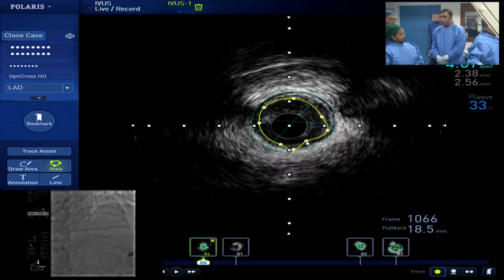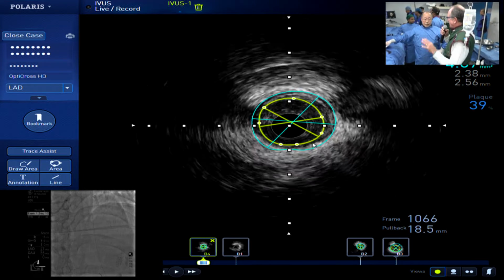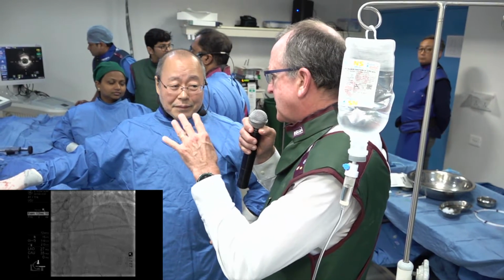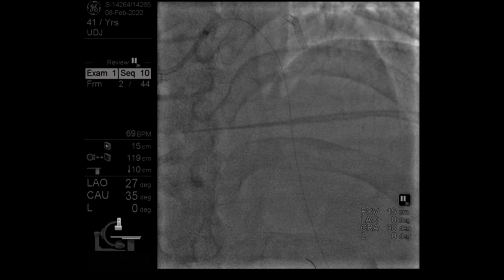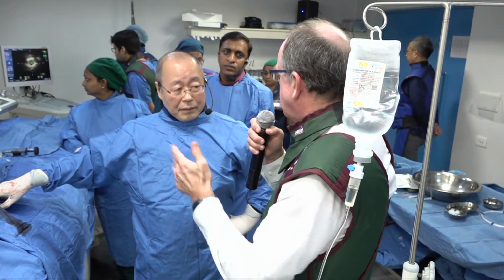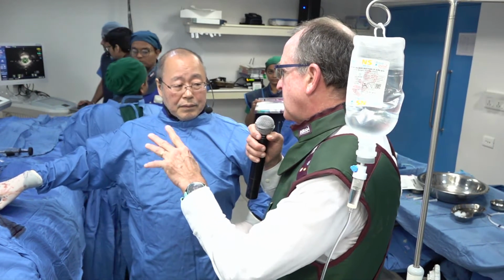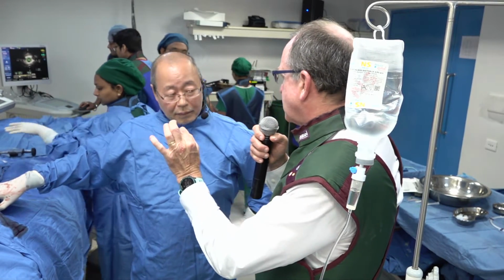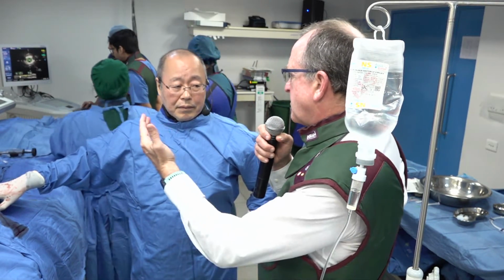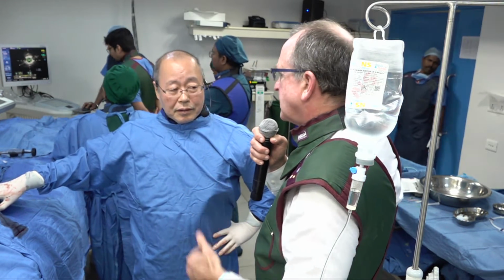I heard you discussing that this has been occluded for a while. It may be a much more narrow vessel now, but I think it has room to grow. But the very proximal part clearly looks as though it's at least 3.5, 4.0. And the only other strategy that some people may think about is whether you stop the stent before the bifurcation. But I think in this case, it's probably better to cross the diagonal. Okay. That's what you're thinking? Yes, that's right.